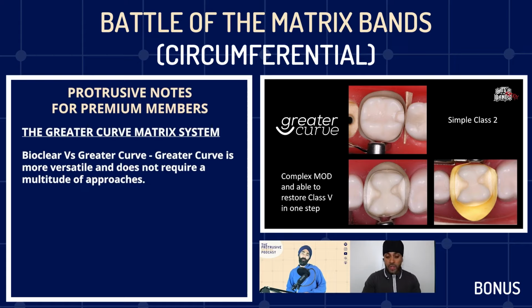So in essence, we can just learn this framework that in principle is the same methodology over and over. You don't need to know 5 or 6 or 10 different techniques for every different situation. Slight nuances, yes, but by and large, this works in much the same way. Tighten cervically, flare coronally, whether that be anterior, posterior, or class 5.